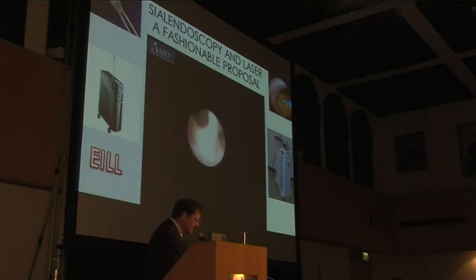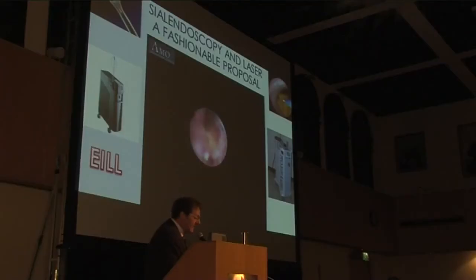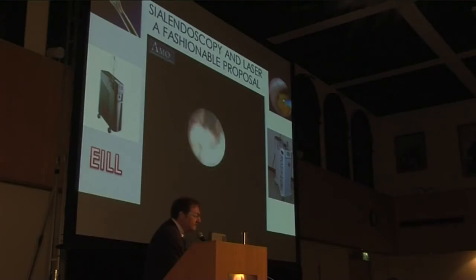Here is the laser system. The major limitation of laser is the possibility to have a ductal perforation after use of the laser system, and also ductal stenosis as a consequence of thermal damage to the ductal wall. I started with this procedure and I'm collecting data. I've had one ductal perforation without any consequence for the patient and two ductal stenoses, requiring glandular massage to favor cleaning of the gland with saliva. But this is a new technique that has to be considered in the future.